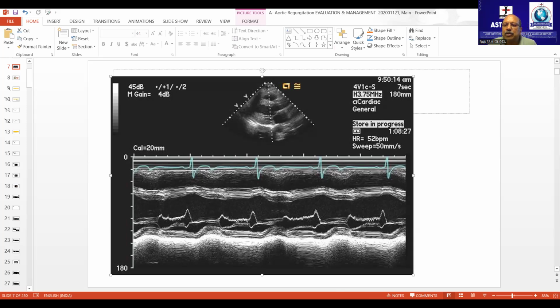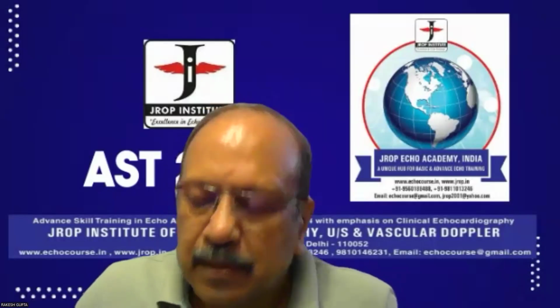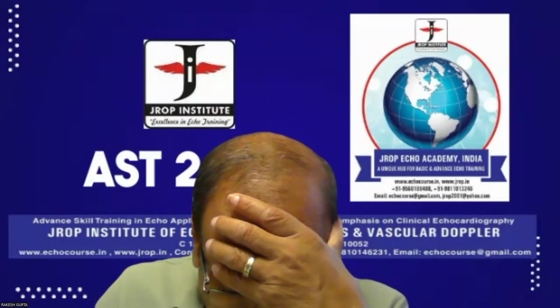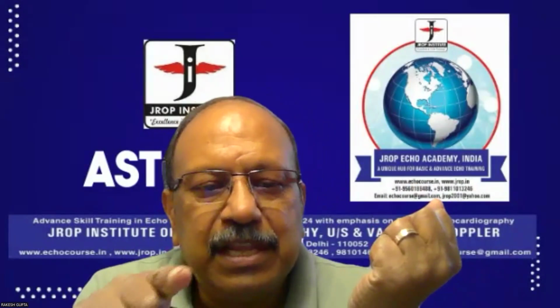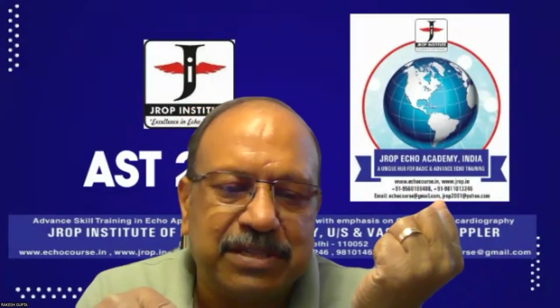Okay, let me stop this presentation here. Sir, in case of AR associated with MS, can we calculate the mitral valve area with the pressure half time, or is it not valid? Both are possible. It could be overestimated or underestimated. If the jet is striking over the mitral valve leaflets, it will be overestimated.